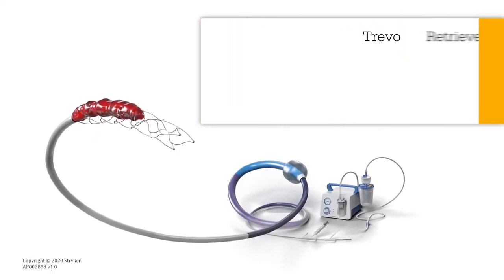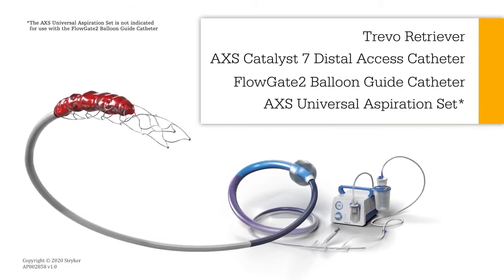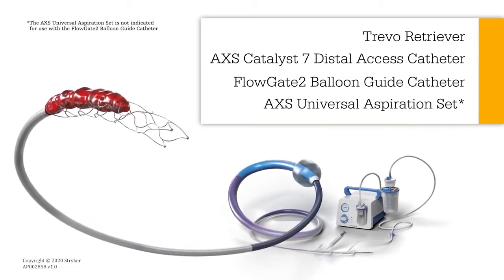The ideal type of mechanical thrombectomy technique, for me over the years, came down to having a balloon guide, an intermediate catheter at the face of the clot, and a stent retriever deployed and interacting with the clot. When all these forces are interacting together, you have aspiration locally and proximally with flow reversal, and you have the stent retriever protecting the clot from embolization and grabbing the clot together with the aspiration.